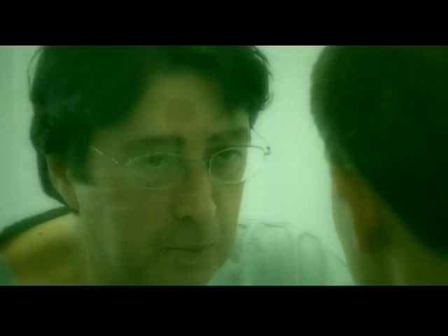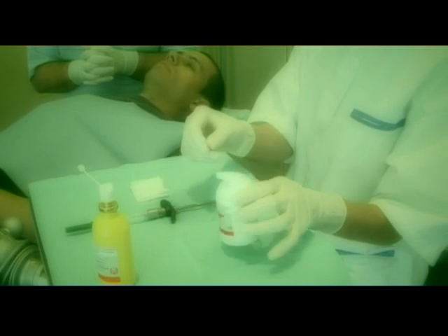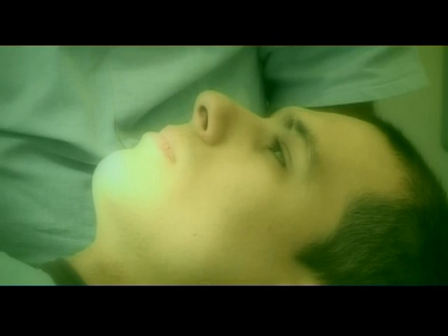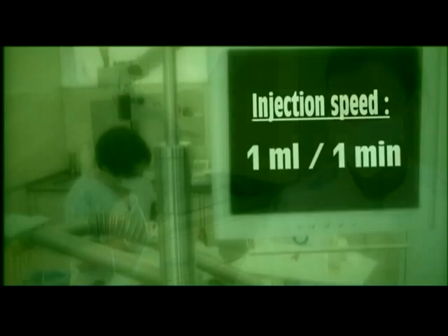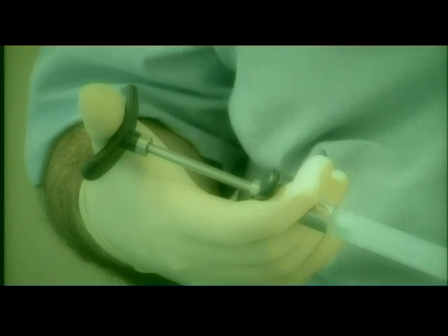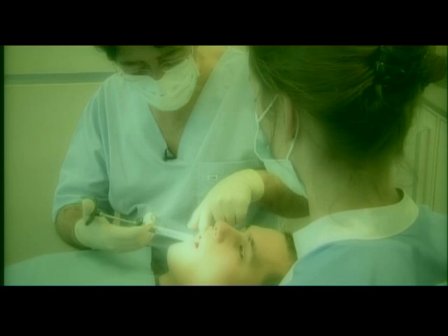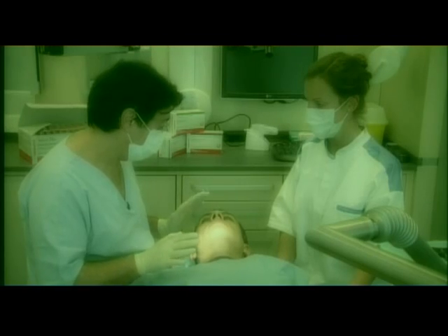This document sets out the essential points for good local anesthesia practices. Aspirate systematically when giving an anesthetic at any site, not just when performing mandibular blocks. All authors recommend that the solution should always be injected slowly, at 1 ml per minute, as this ensures the solution remains in contact with the nerve trunk, thus reducing pain and systemic effects. A slow injection will save time later.